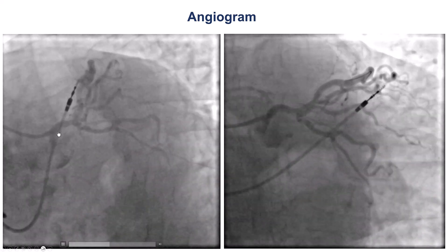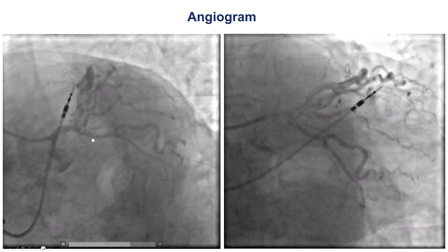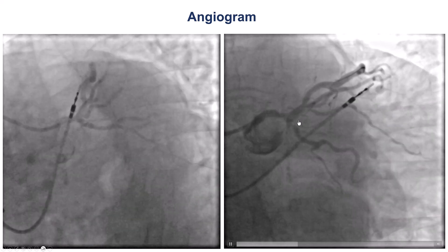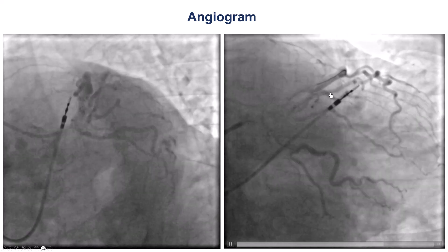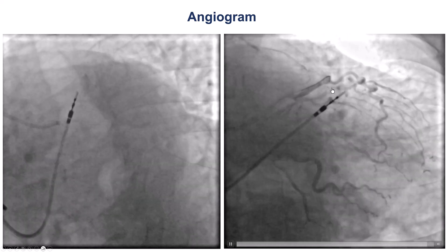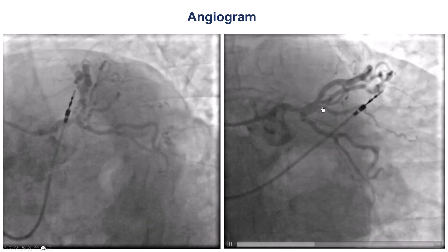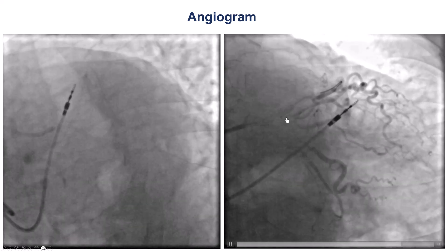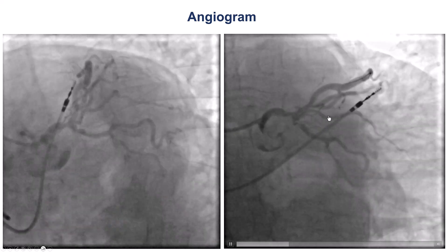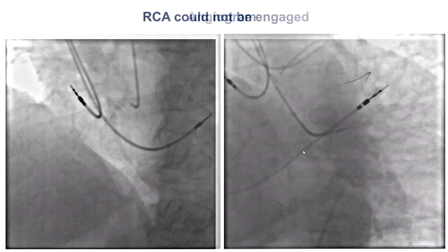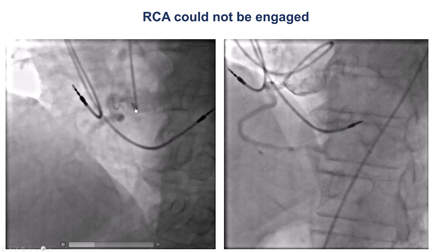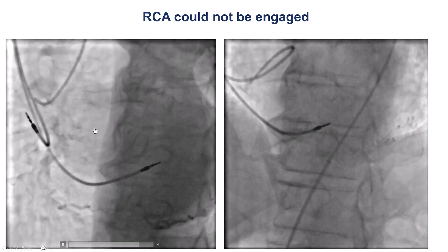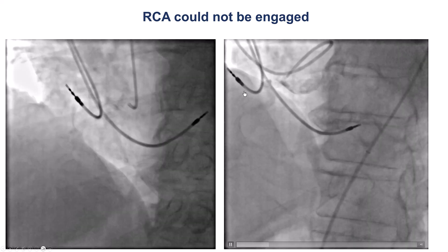The procedure was done through radial access with very difficult engagement, so to be able to visualize we actually had to use a wire to anchor the catheter. But eventually we obtained images of the left coronary artery. There are some intermediate lesions in the circumflex and the LAD, but we had extreme difficulty engaging the right coronary artery, which seemed to have an ostial lesion.